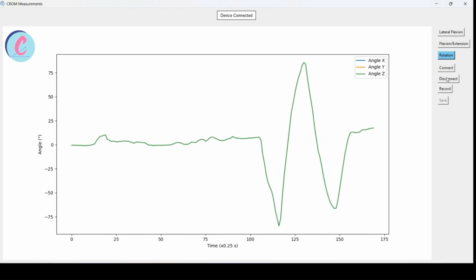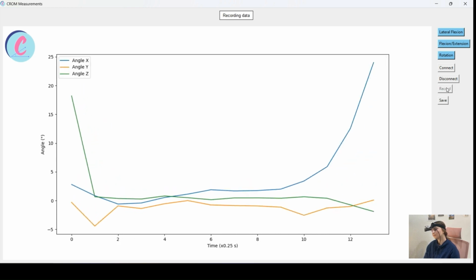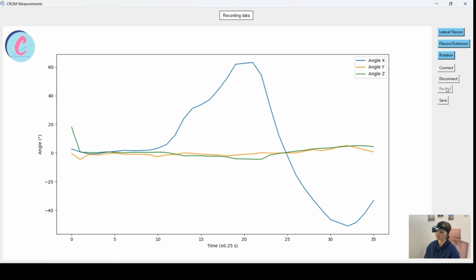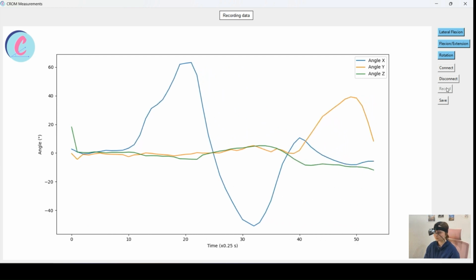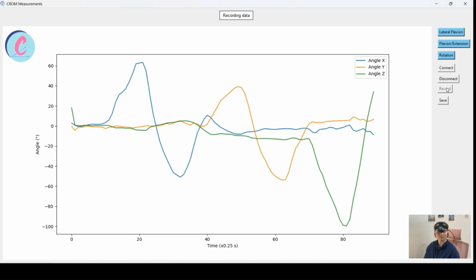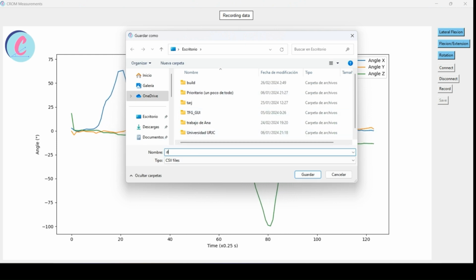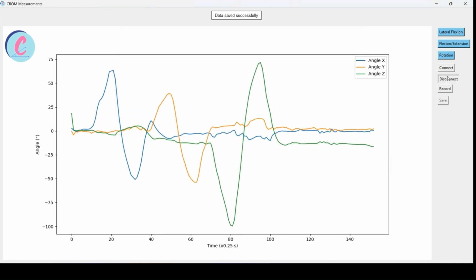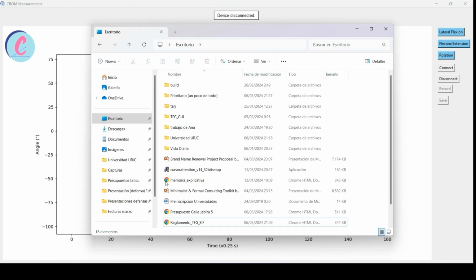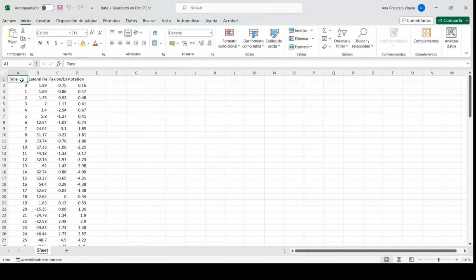We'll disconnect the device now and connect it one more time in order to show the functionality of the record button. So we connect it one more time, we click the record button, and now all the data that the sensor is acquiring is being recorded. Our participant is performing several movements for this purpose. And once the save button is clicked, all this data will be saved in a CSV or an Excel file. We can choose the directory where we want to store this file. And if we open it, we'll see all the angles that the patient acquired while performing each one of the movements, as you can observe here.